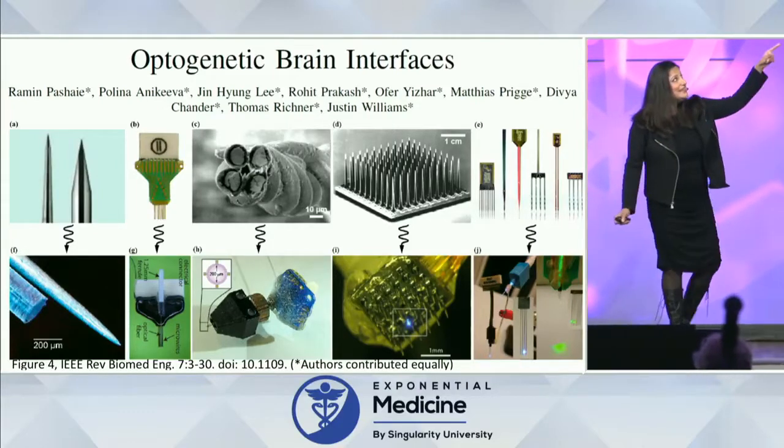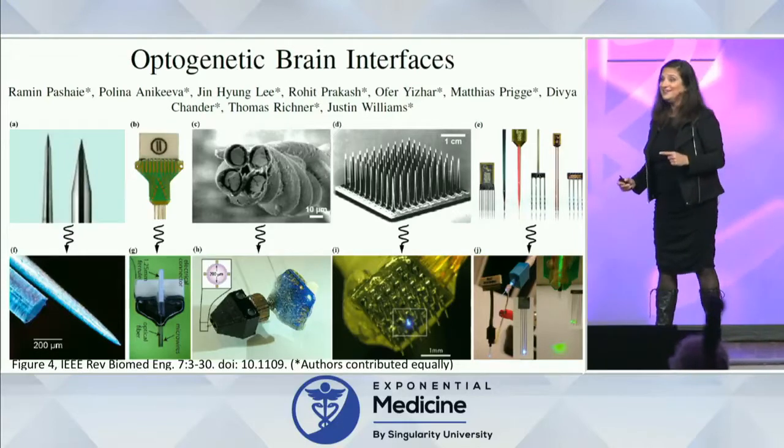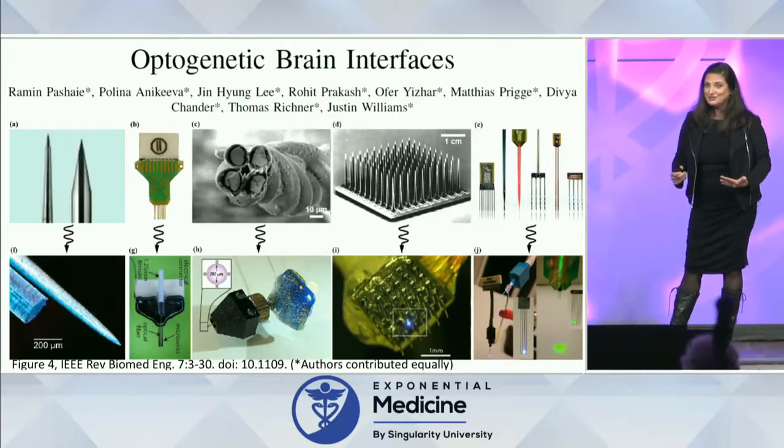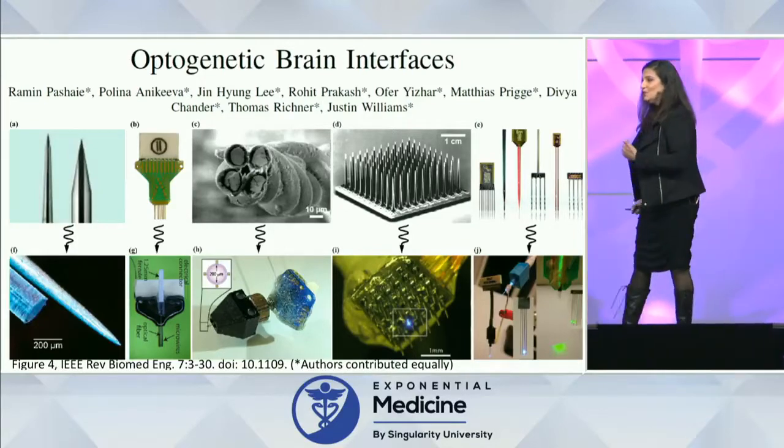This was in 2014. And as you can see, almost every single device that we put up there is invasive, right? And that's a problem, because if we're going to help most of humanity, we need to find a way to actually modulate brains without cracking open skulls, because most people are not going to want to consent to that kind of brain surgery.